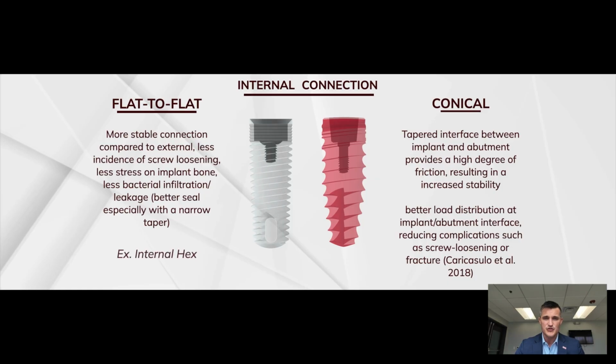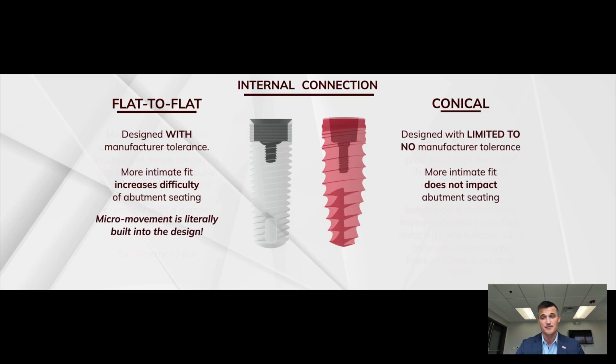But when we look at internal connection, we need to separate between conical connection implants and flat-to-flat interfaces, which would be considered internal hex. Conical connection implants have been shown to be much more stable. Let me first say, micromovement is actually built into the design of an internal hex implant.